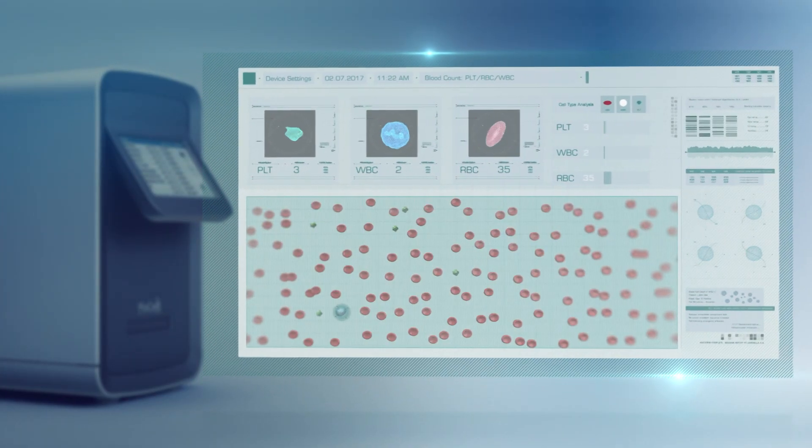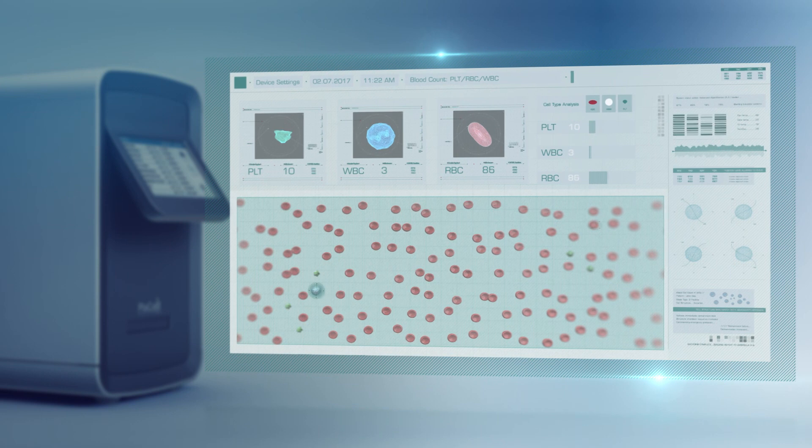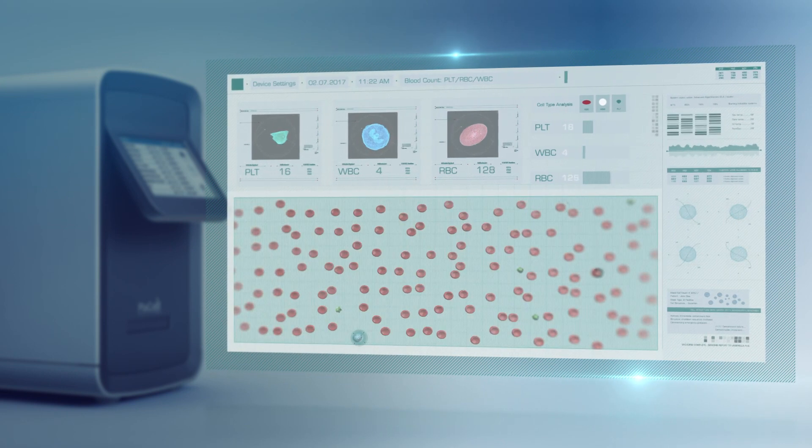Initially, the system counts the red blood cells, white blood cells, and platelets based on the cell's shape, size, and color.